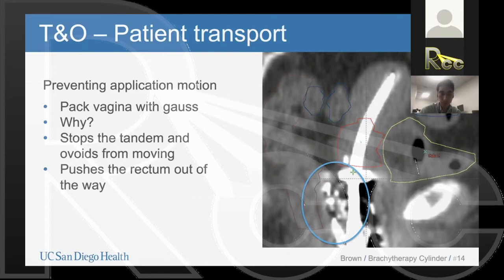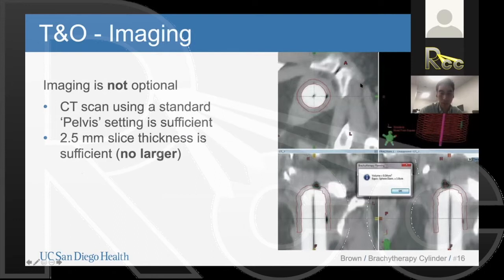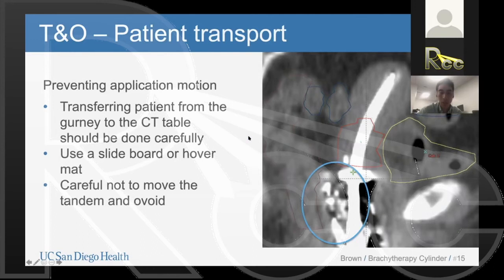Derek, yes, I think this is a perfect time. George from Sweden Ghana Medical Center in Ghana asked a question regarding the dose distribution. Should it always be pear-shaped, taking into account the given HRCTV and some OARs closer to the applicators? And I think your comment about using the gauze to push the OARs away is a helpful insight.